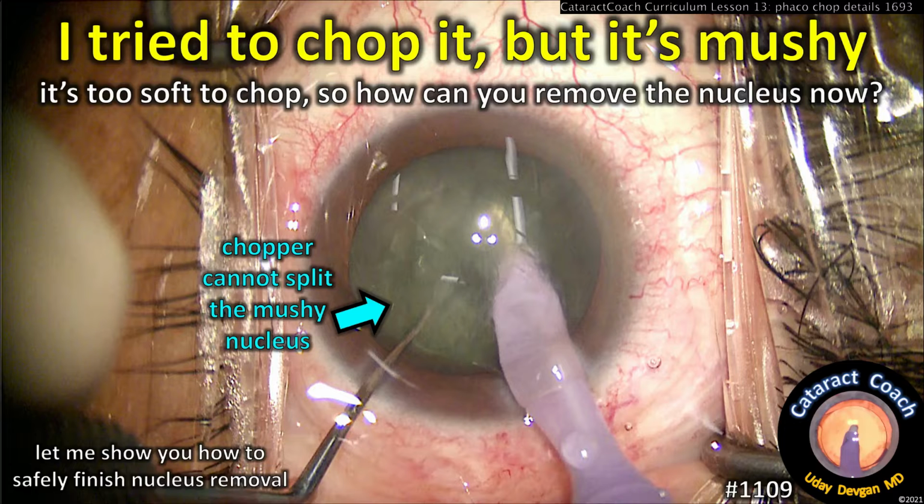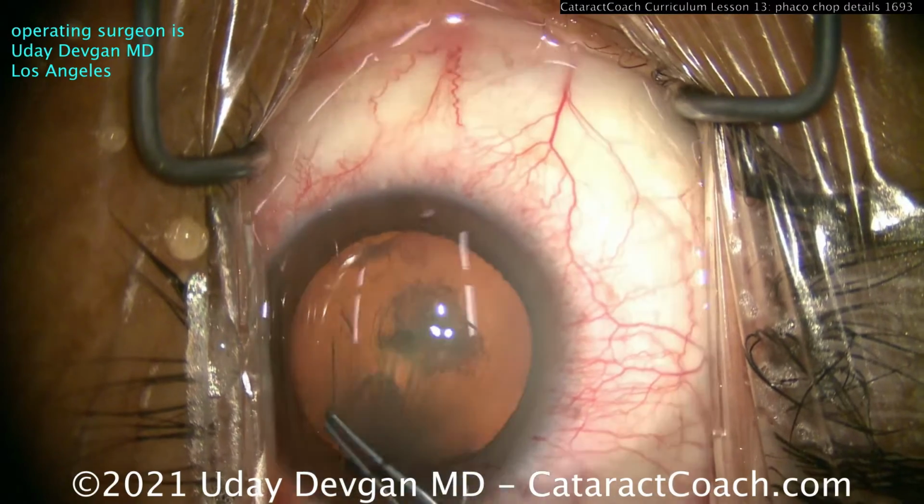I tried to chop it, but it's just too mushy. It's too soft to chop, so how can you remove the nucleus now? Let me show you this case.